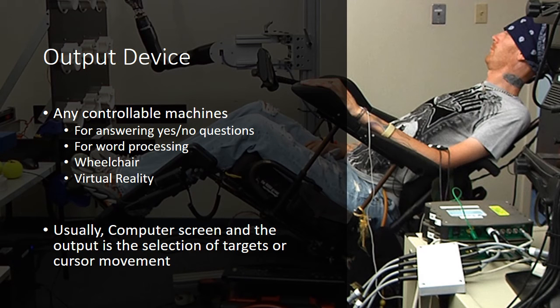Output device can be any controllable machine, and it can be used for answering yes/no questions, for word processing, and it can be a wheelchair, it can be a prosthetic device, it can be a virtual reality. Usually, a computer screen is placed before the user, and the output is the selection of the targets or the cursor movement of the BCI.